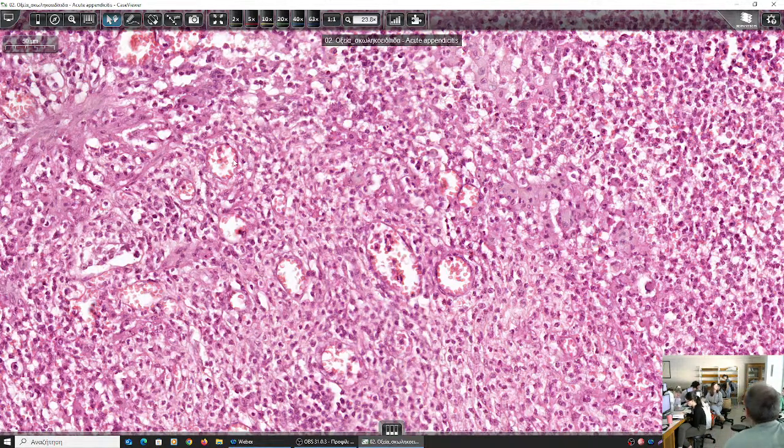What is this called? This is called an what? Ulcer. An ulcer, yes. Excellent. This is called an ulcer. So this is ulcerative inflammation. What is an ulcer? Destruction of a covering epithelium, either the skin covering epithelium, squamous, or the esophagus, squamous epithelium, or the stomach, glandular epithelium, the duodenum, the large bowel, and replacement with granulation tissue. This is called an ulcer.